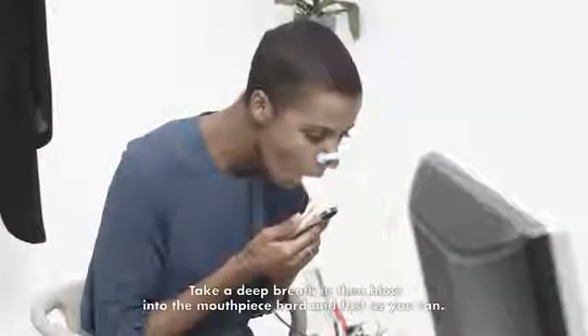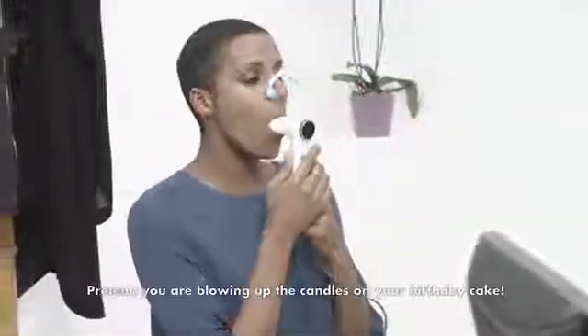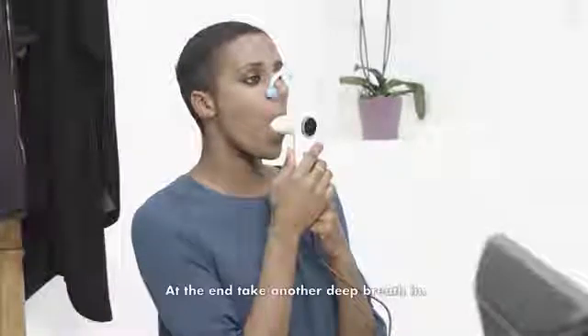Take a deep breath in, then blow into the mouthpiece hard and as fast as you can. Pretend you are blowing out the candles on your birthday cake. Try to keep blowing for at least six seconds. At the end, take another deep breath in.